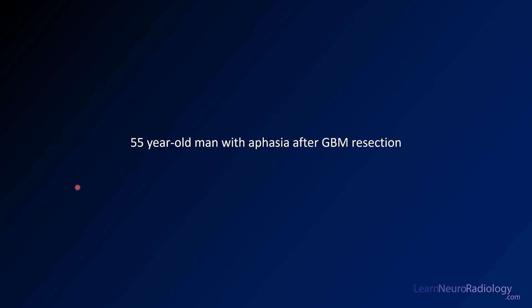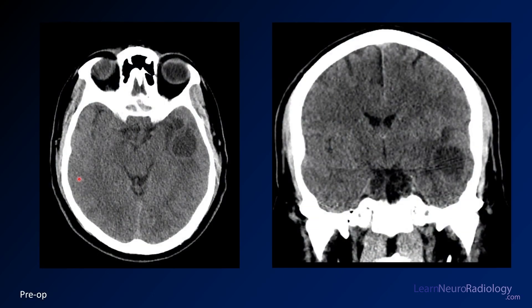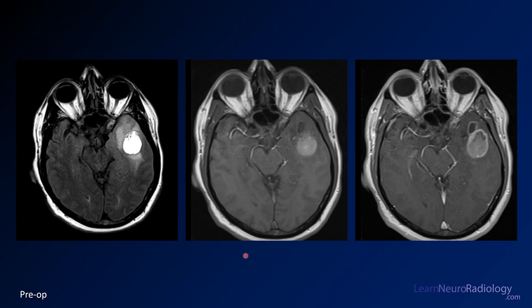Here's a case example. This is a 55-year-old man with aphasia who had a glioblastoma resection. Here is his pre-op imaging — you see a low-density lesion with some peripheral hyperdensity in the left temporal lobe on coronal CT. On the pre-op MRI, there are some necrotic blood product areas and some enhancement. He has this tumor in his temporal lobe.